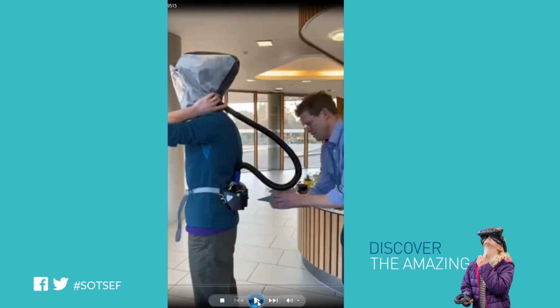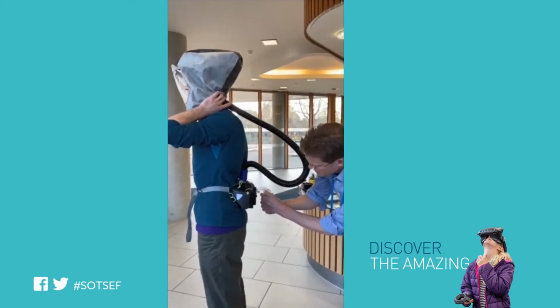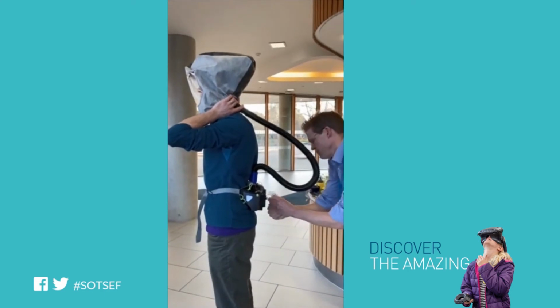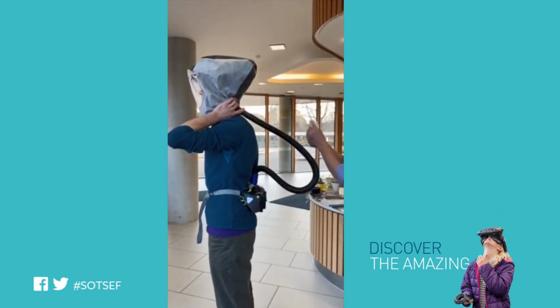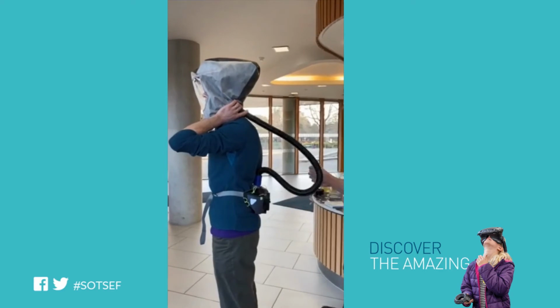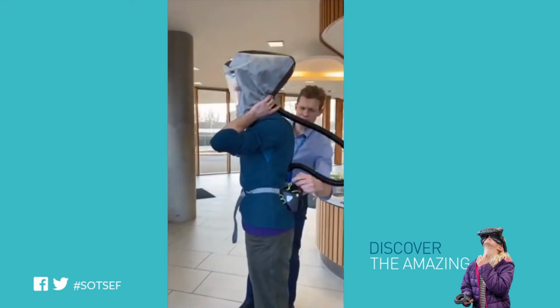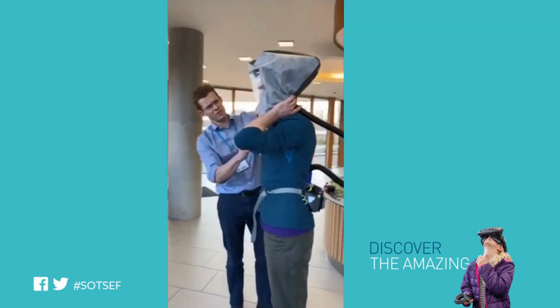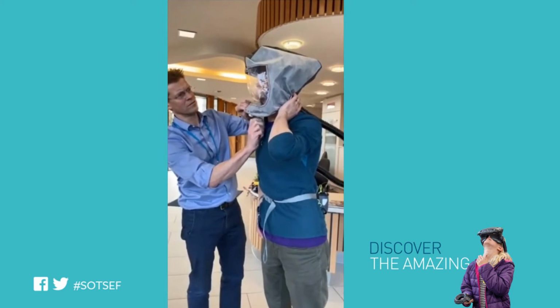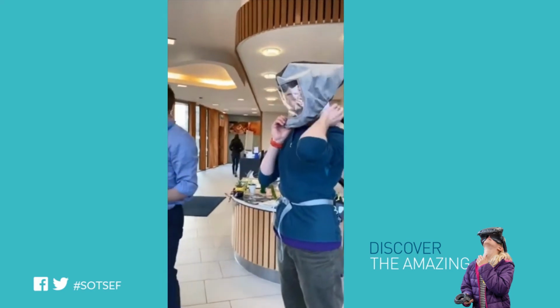I've just realised this is our first spray test, where we're testing the fit and the air tightness of all parts of the assembly except for the filter inlet. This is actually Paul Elkington, whose idea it was to tackle this. He's using an atomizer to spray a bitter tasting solution into the air inlet, so I'll be able to taste whether anything is getting around the seals of the filter unit. We then turn the device off, and just to test that I can actually taste it, he's spraying it inside the visor, and you see how rapidly I have to get the visor off as soon as the taste comes through.